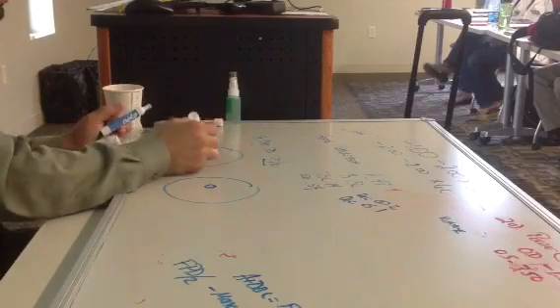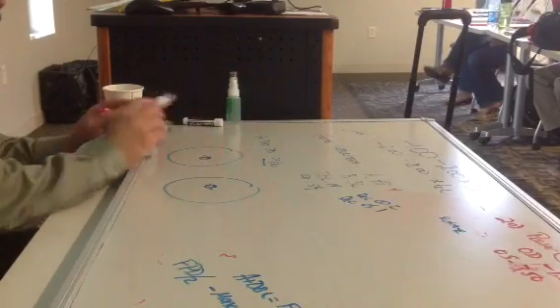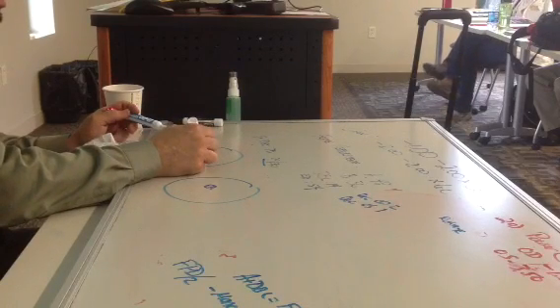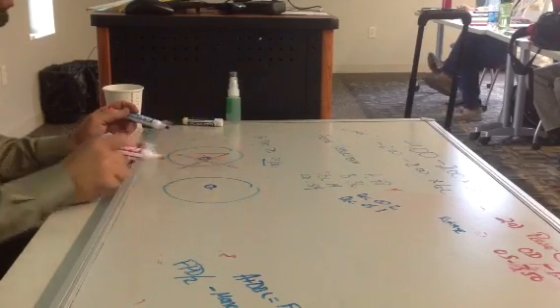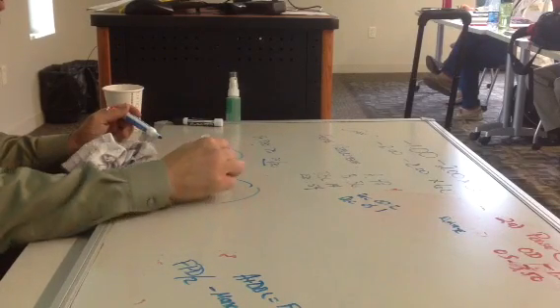So instead of putting this optical center dead center, here's your optical center of the frame, and we should have gone 2 in, we went 4 in, 1, 2, 3, 4. The optical center now is too far in by 2 millimeters. Left eye, instead of going 1 in, we went 2 in.